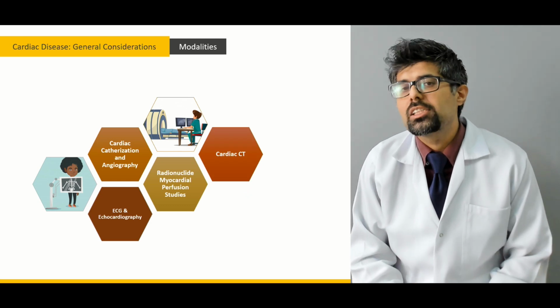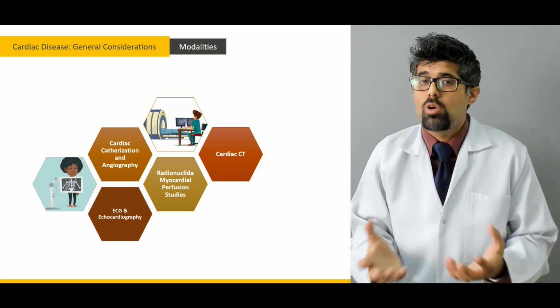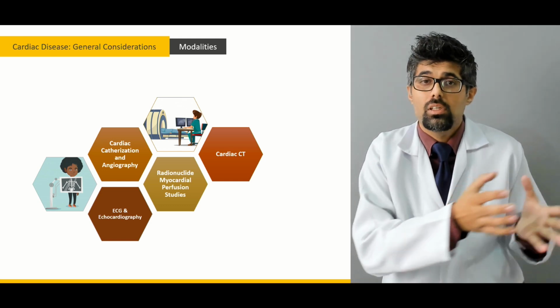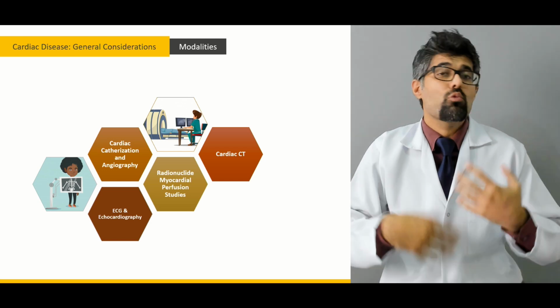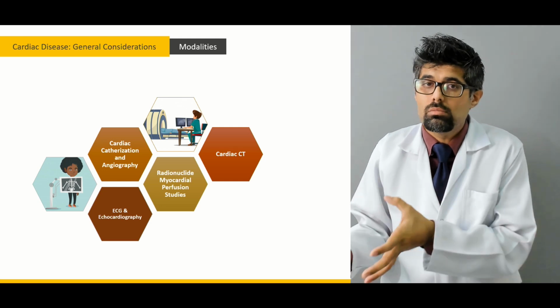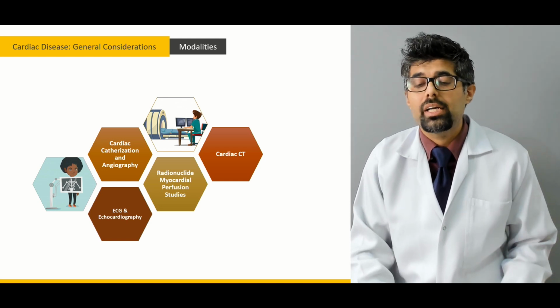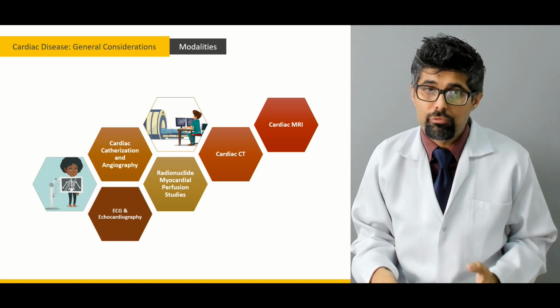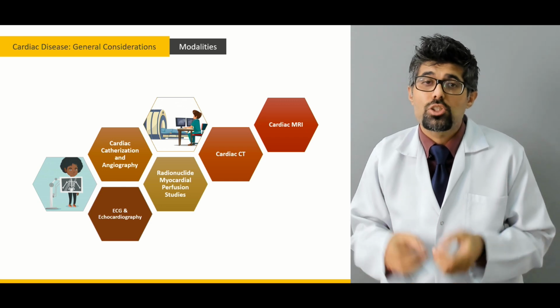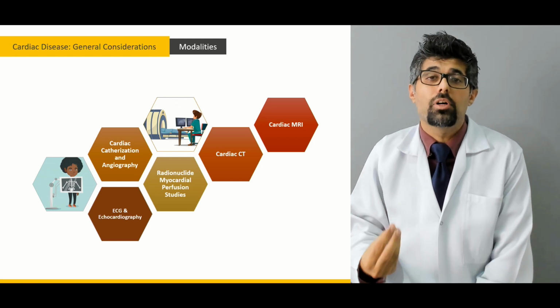Next, we have the cardiac CT. Cardiac CT is performed in those patients who have either unstable angina or do not have ST segment elevation, in which we do have time to perform the imaging to confirm the state of the heart, how the heart is performing. In those patients, cardiac CT and MRI is performed. This gives us a very good idea of how much the heart has been compromised or how much the heart is working.